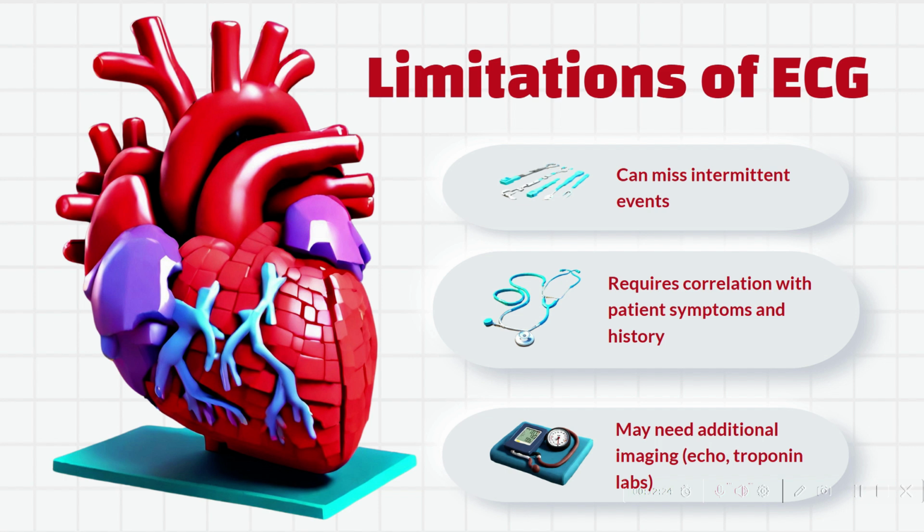Additionally, ECG interpretation must always be correlated with the patient's symptoms, clinical history, and physical examination to avoid misdiagnosis. For instance, nonspecific ST wave changes may not necessarily indicate myocardial infarction and could be related to electrolyte imbalances, medication effects, or structural heart changes.